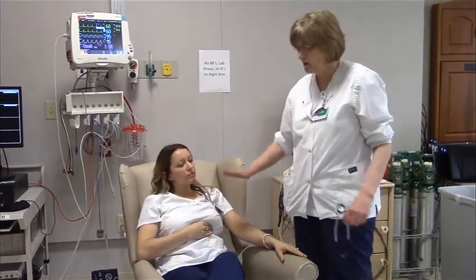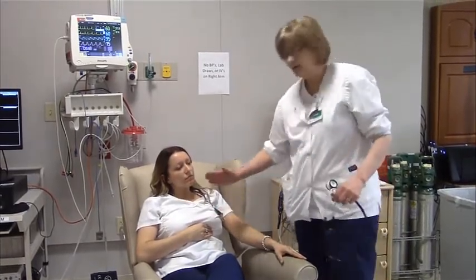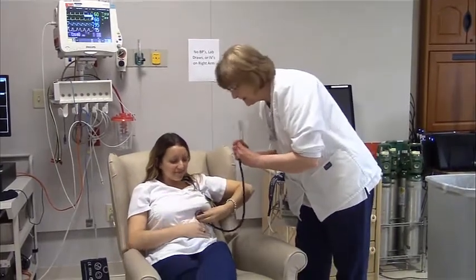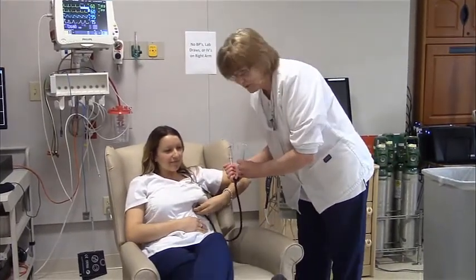So that means my patients will have to lift up the breast tissue to be able to place the stethoscope. Now, Stacy and I work together, so I am allowing her to place the stethoscope for me to listen. All right? You will be doing this for your patients.